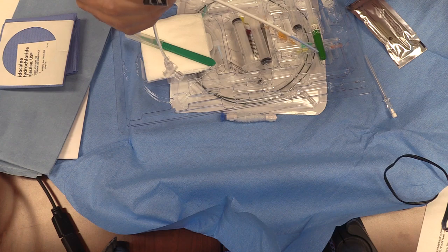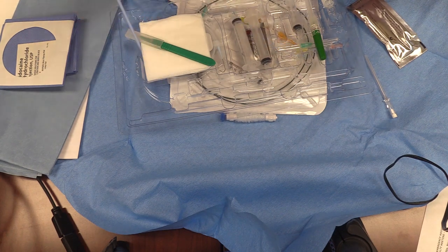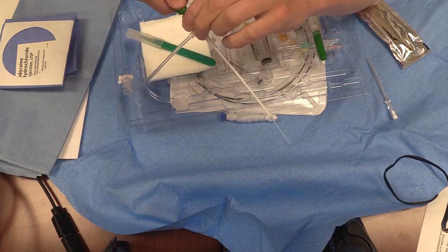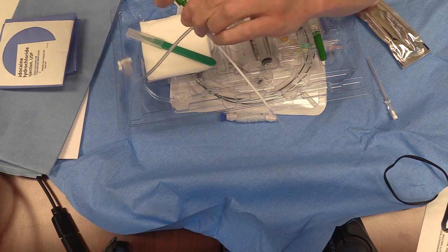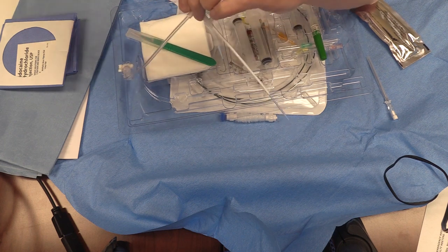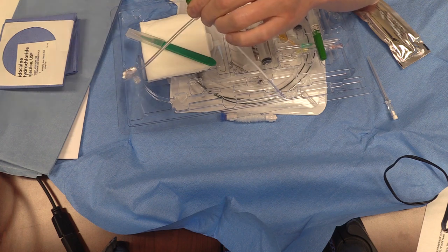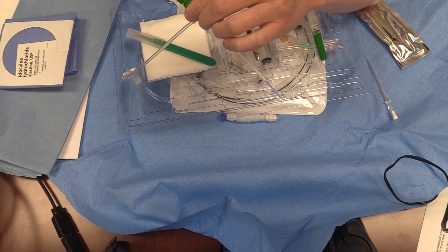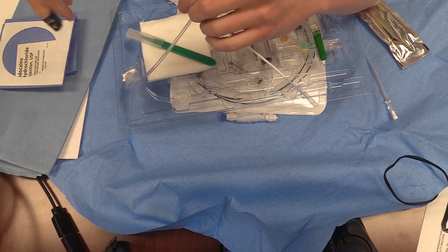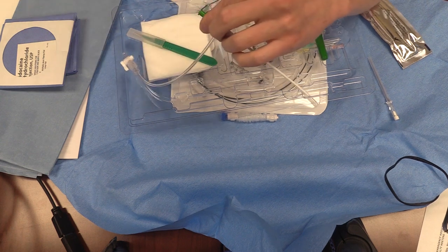Placement is just like you're familiar with: needle, wire, nick — place this in as one unit. Once it's in, you can hold the wire and the internal dilator and take them out together. If you're not dexterous enough for that, just pull out the wire and then take out the internal dilator. But there's a moment when they're exposed to air and air embolism risk is a potential. So it's always nicer to grab the wire in your pinky, grip the dilator, and take them all out as one unit.